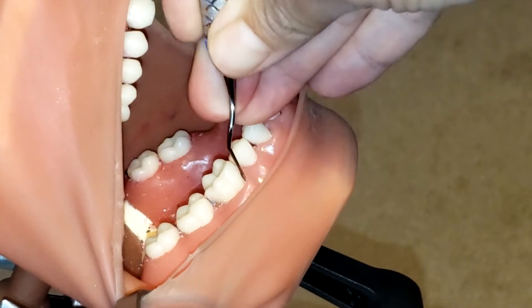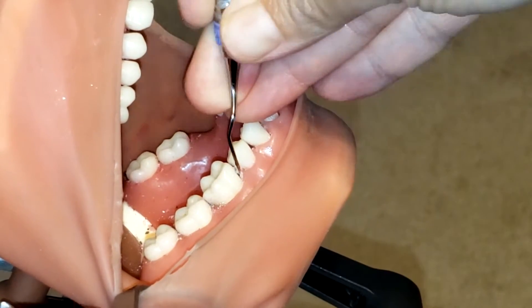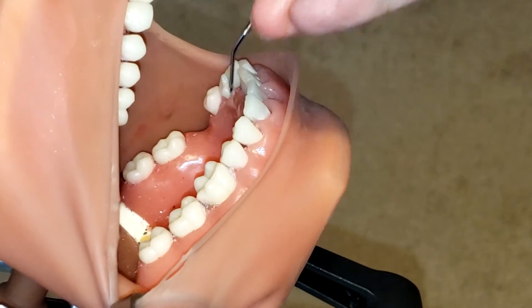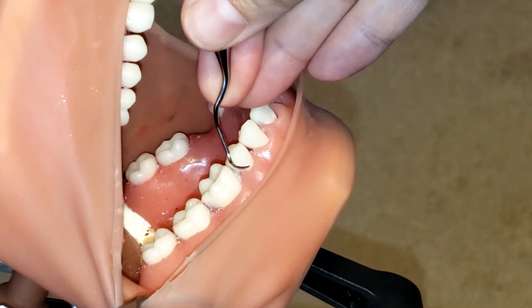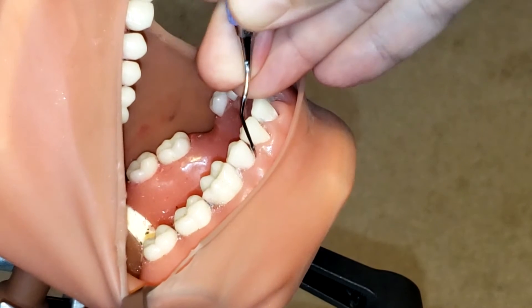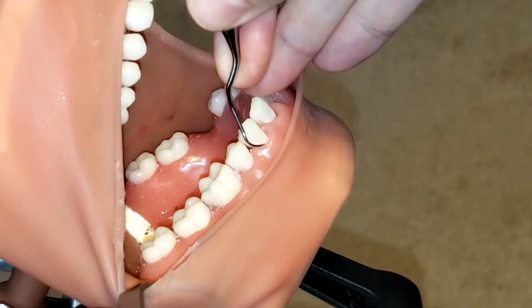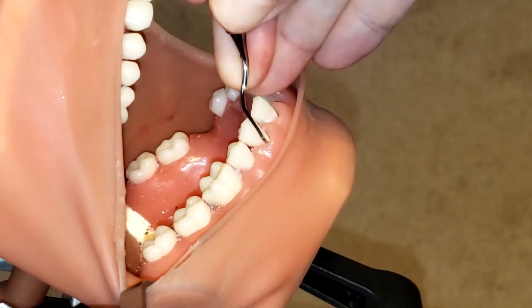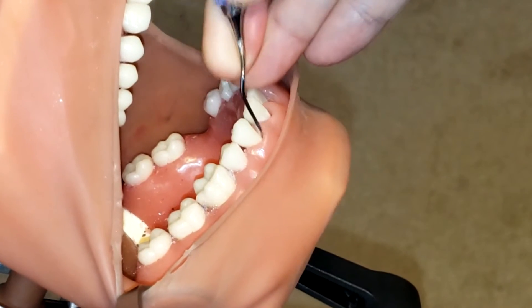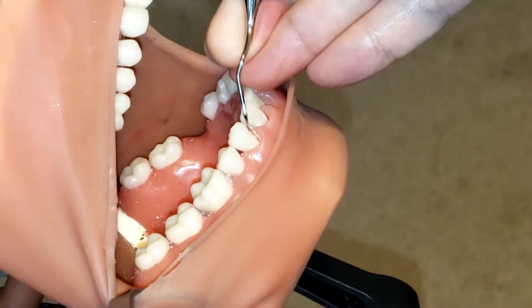Because this is a periodontal instrument, you can go very deep into those hard-to-reach pockets. Also make sure you are keeping that lower shank as parallel as possible to the long axis of the tooth.